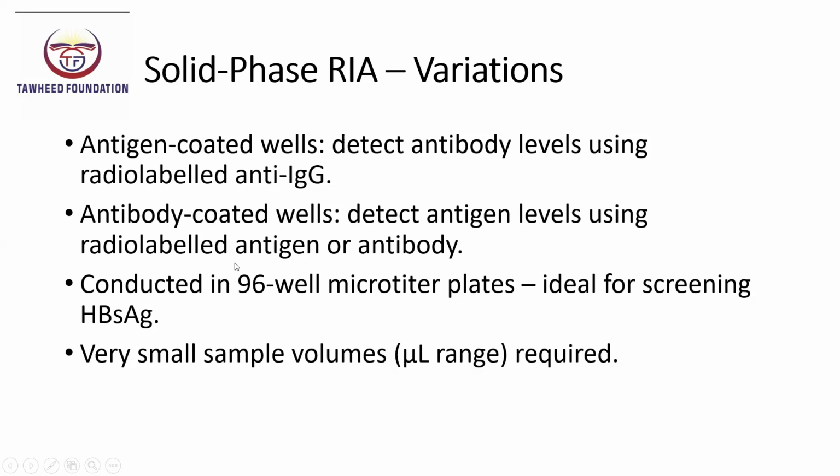Antibody coated wells are employed for the detection of antigens. In this setup, the specific antibody is adsorbed on the solid surface and the patient's antigen competes with the radiolabeled antigen for binding. These formats are often performed in 96 well microtiter plates, which are compatible with automated handling systems.